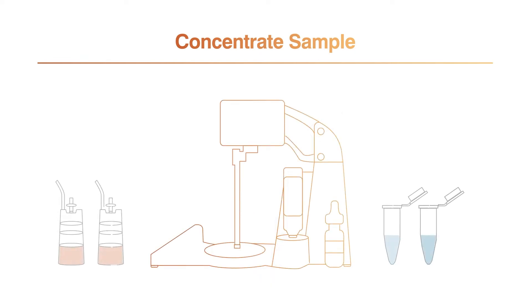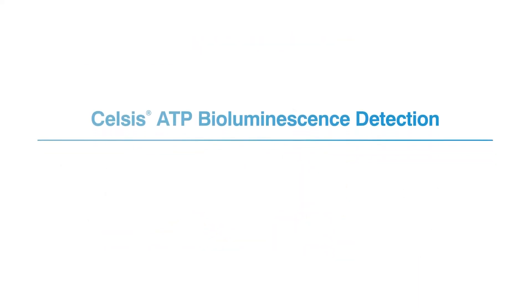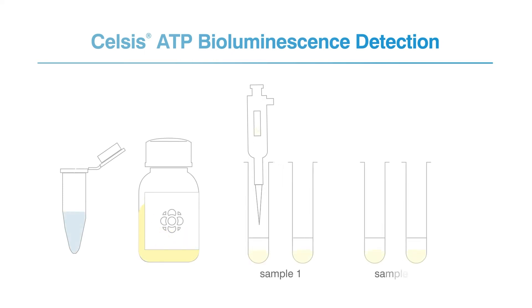This concentration process is repeated for each incubated sample and media type. Using a repeating pipette, add 50 microliters of Celsis Luminase reagent to Celsis assay cuvettes. Then transfer 50 microliters of concentrated sample, in duplicate, to the cuvettes containing the reagent. These cuvettes are then loaded into a Celsis instrument.